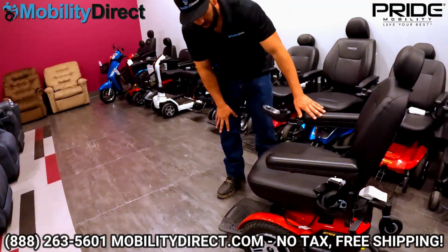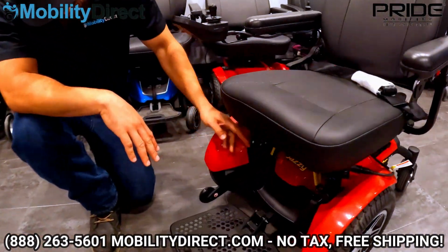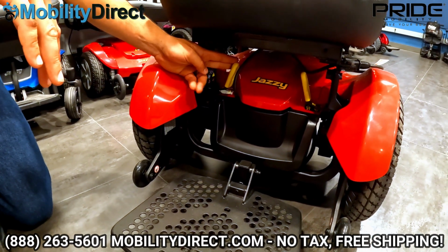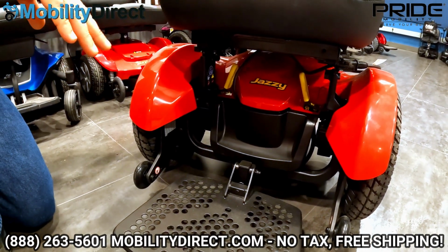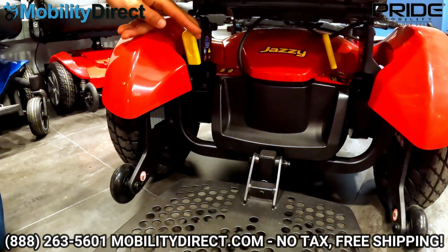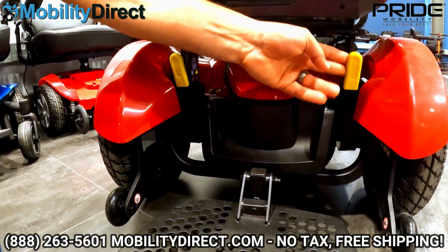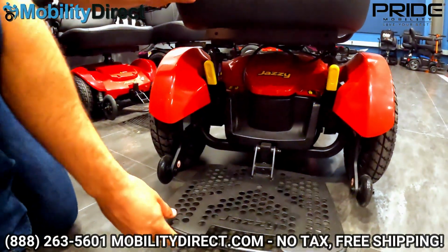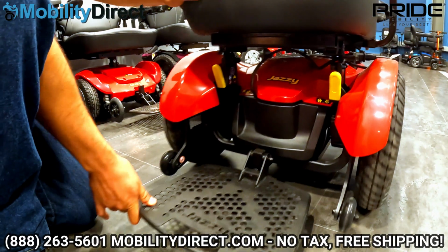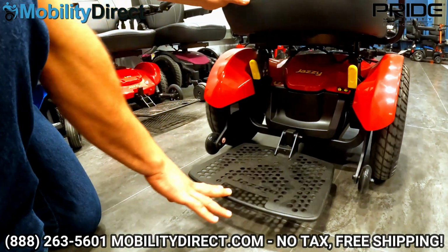Now this power wheelchair, like all power wheelchairs, has 2 motors, and they each have an electromagnetic brake lever attached to them. So if you want to push the chair manually without using the joystick, you can disengage these levers by bringing them to the outward position, and that unlocks the braking system. So now I can actually manually push the chair. So if your batteries die, you're not going to be able to move it unless you unlock those brakes.